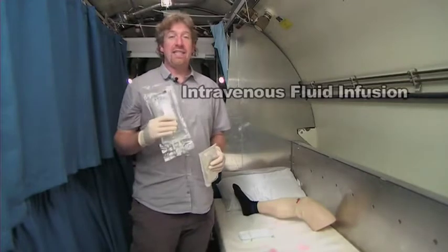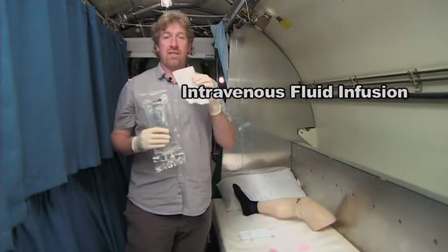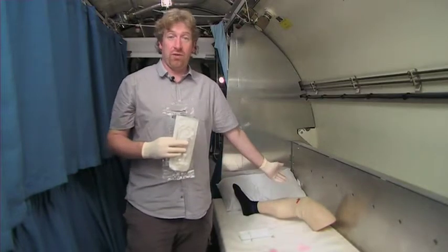What we're now about to demonstrate is setting up an intravenous fluid solution using the giving set, to be given into a vein in the arm or using an intraosseous route.